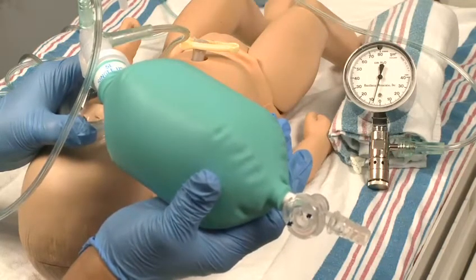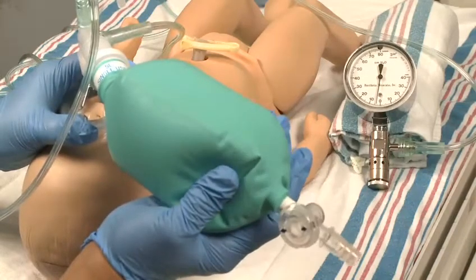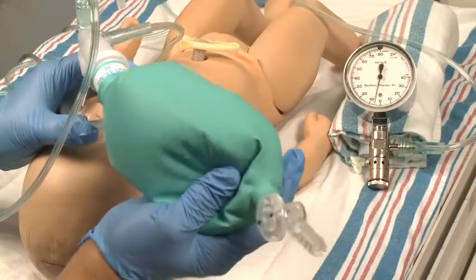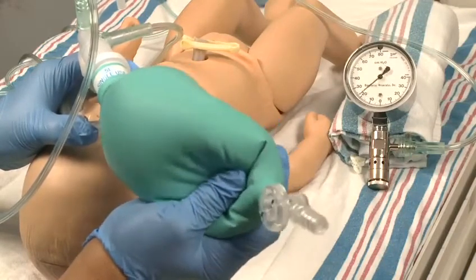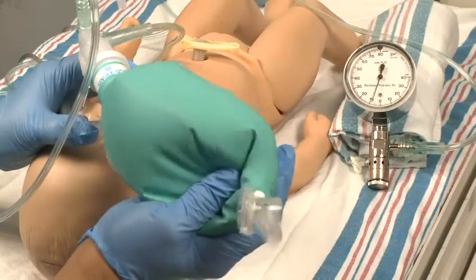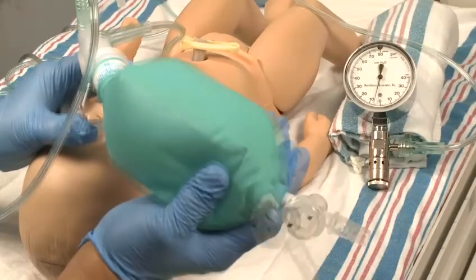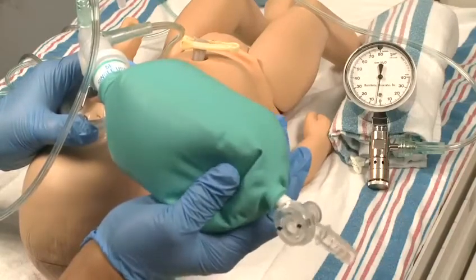The flow inflating bag is also called an anesthesia bag. A pressure gauge registers the amount of pressure being used to ventilate the newborn and helps you avoid excessive pressures. The pressure gauge measures the amount of inspiratory pressure when you give a breath and can also measure the end expiratory pressure, which is the amount of air pressure remaining in the system at the end of a breath.